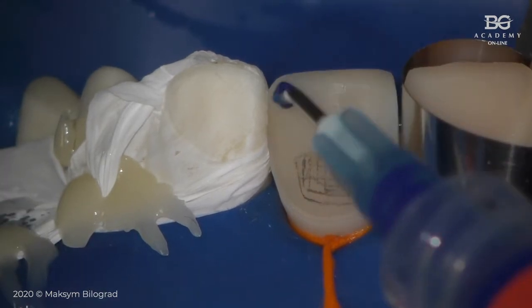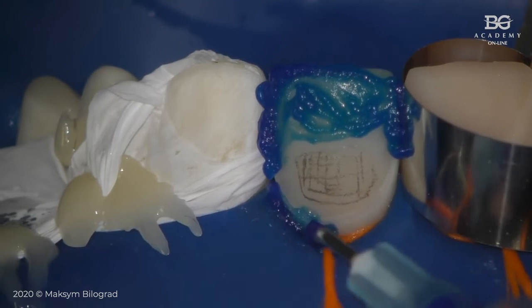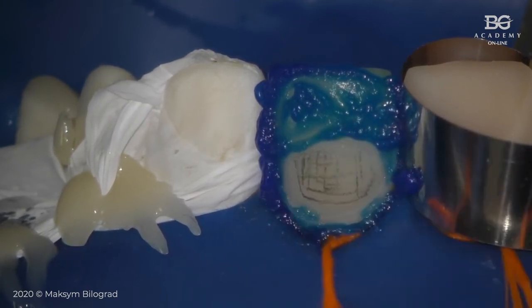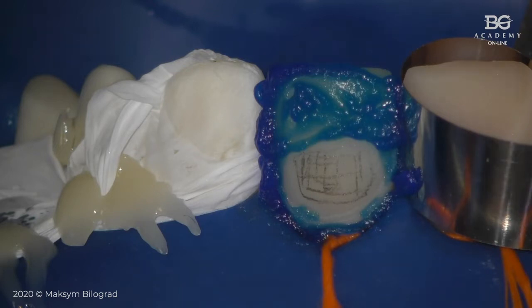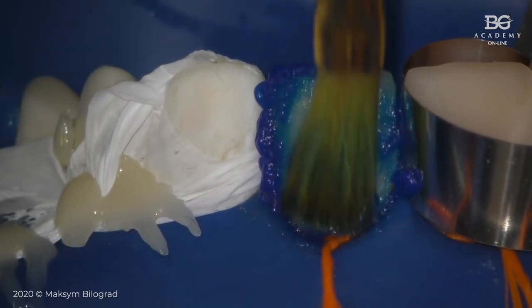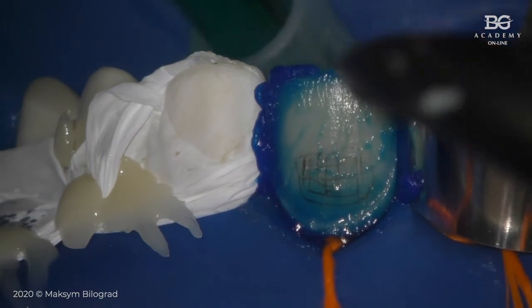I will etch enamel with phosphoric acid, just enamel, for 20 seconds, okay? If you are using a self-etch system, again, after 30 seconds you will rinse it out, dry, and then go for the second step that I will show you. If you use a total etch system, we keep acid gel on enamel for 20 seconds, then we spread it gently on the area of dentin. Now we count for 5: 1, 2, 3, 4, 5, then we rinse.